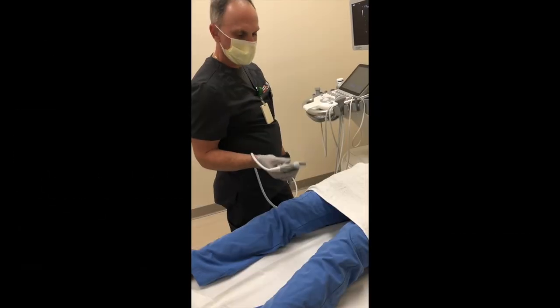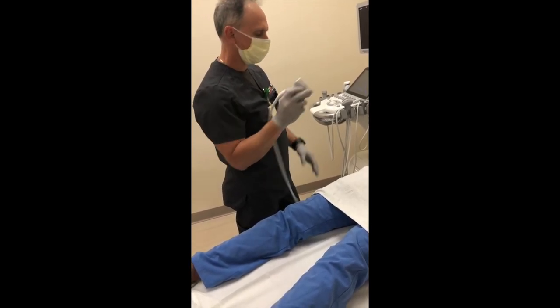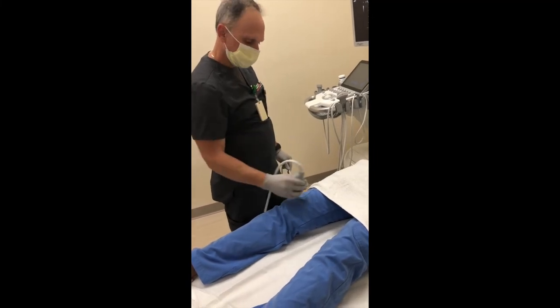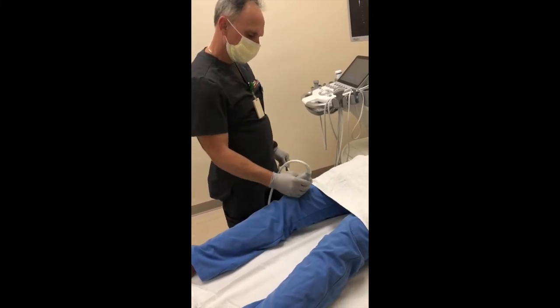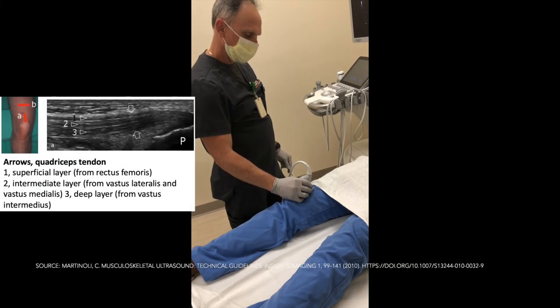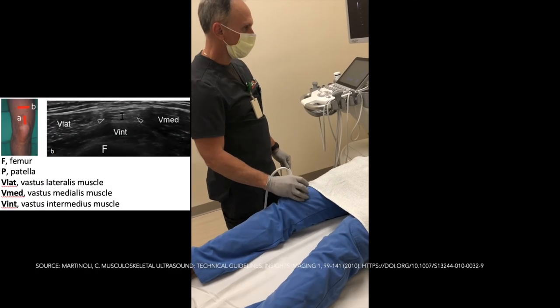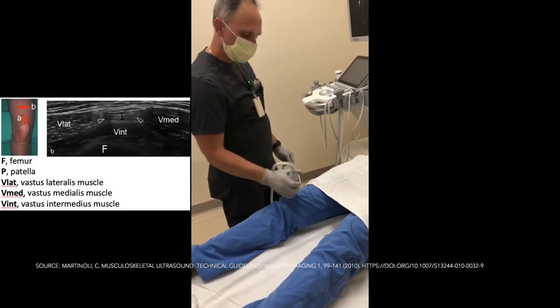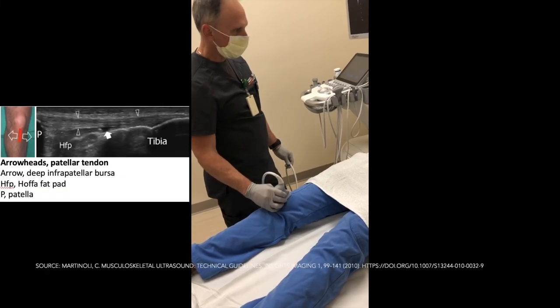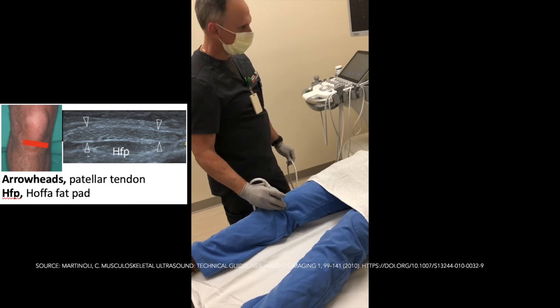We're going to use the 18L6 transducer. We'll start off in long axis, looking right above the patella, starting with a quad tendon evaluation in long axis and then short axis. From there we can also go to the patellar tendon, again in long axis and then short axis from superior to inferior.